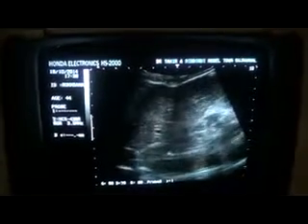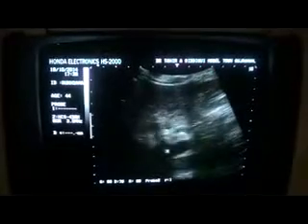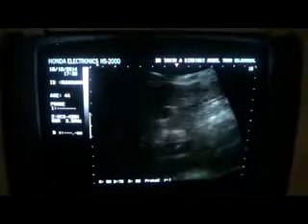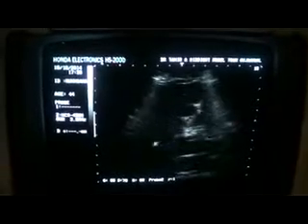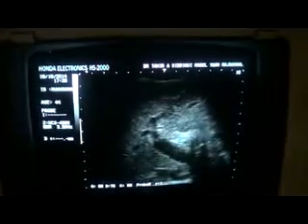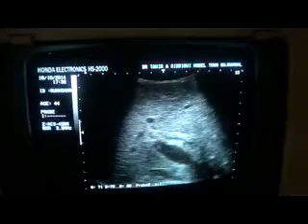The gallbladder has been surgically removed, and you can see this is the portal vein. This is the portal vein, normal. However, the liver will show you coarseness with diffuse increased parenchymal echogenicity. This is the portal vein, and see the texture of the liver.